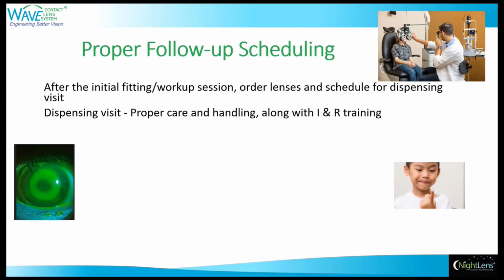And it's a very good idea to give them support from you, the doctor, coming in and patting them on the back and telling them what a great job they did. They're very proud of themselves once they're able to insert and remove lenses by themselves. And it wouldn't hurt to give them a little gift or a snack once that is achieved.